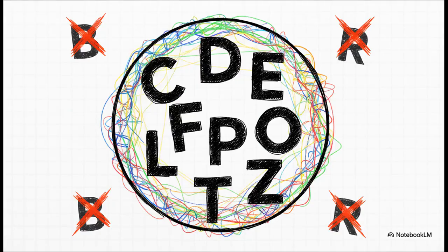And this really drives the point home. You can't just use any letter. I mean, ever wonder why there's no B or R? Well, it's because their shapes are more complex, which makes them easier to guess even when they're blurry.